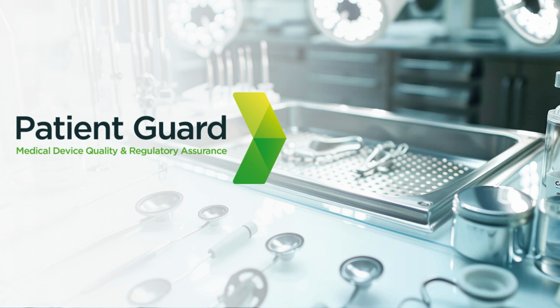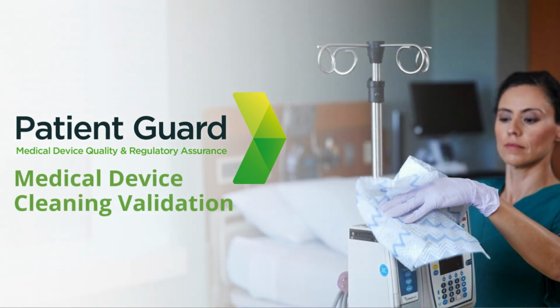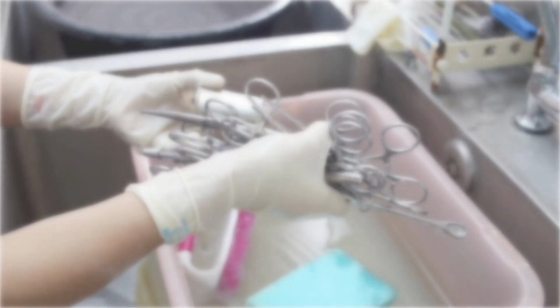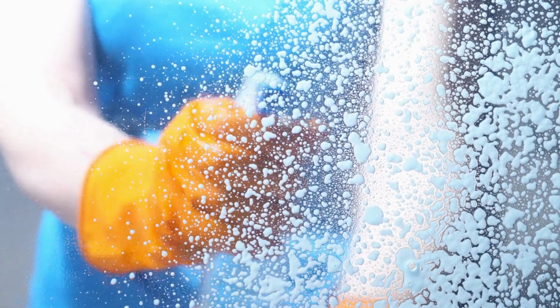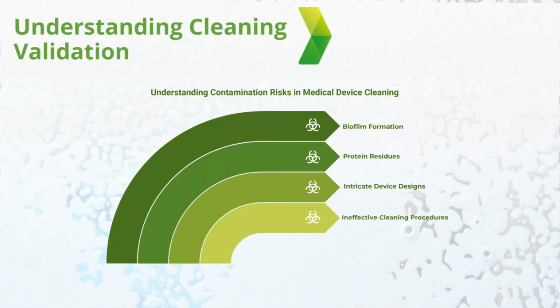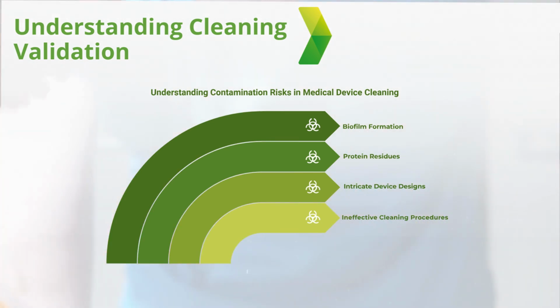Today, we delve into a critical aspect of medical device reprocessing, cleaning validation. Ensuring that medical devices are properly cleaned is essential for patient safety and infection control. Cleaning validation is a documented process that verifies the effectiveness of cleaning procedures in removing contaminants from medical devices. This process ensures that devices are safe for reuse on patients, preventing potential infections and complications.